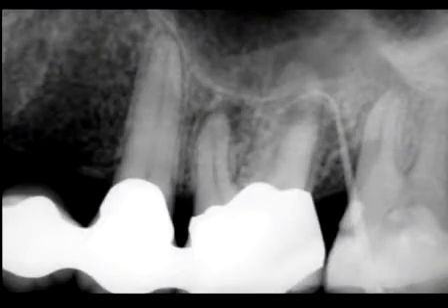Let's look at an access cavity of a maxillary molar. This first molar has a fistulous tract that's being traced with a gutta percha point. Notice the crown extends gingivally and we cannot identify the pulp chamber. Access cavities need to be well planned so that we can avoid iatrogenic events.